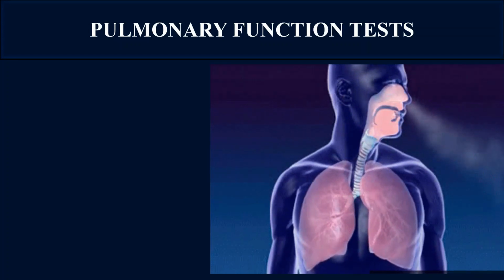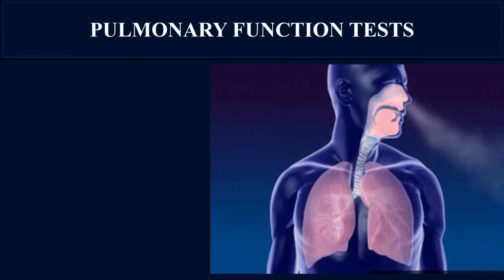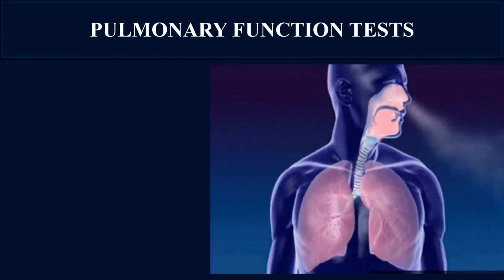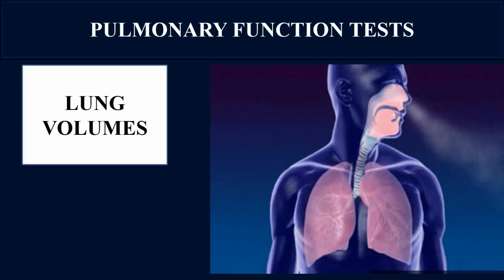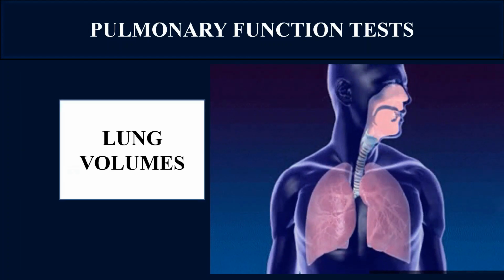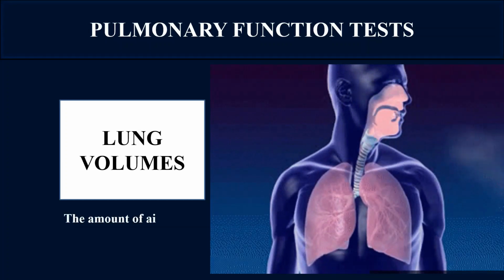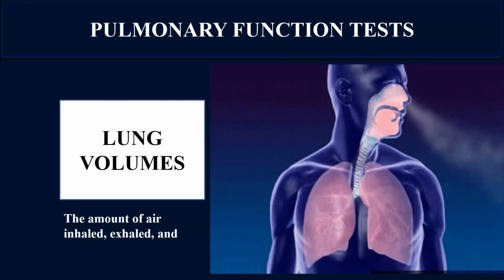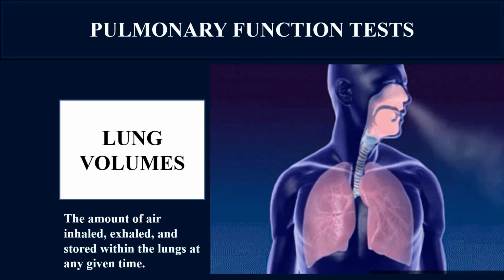As the respiratory system is involved in the inhalation and exhalation of air, in the pulmonary function test the air is measured by measurement of lung volumes and lung capacities. Here in this video, I will explain the lung volumes. So what are lung volumes? Lung volumes is the measurement of the air that is inhaled, exhaled, and stored within the lungs with respect to time.